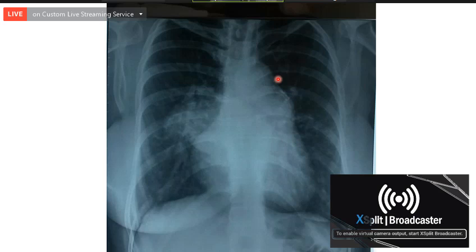So here, this is the transverse process. You can see the transverse process somewhere here. So yes, it definitely is beyond the transverse process of the vertebra. So this can be considered as a prominent aortic knuckle. Okay. What else? What about the pulmonary artery segment?